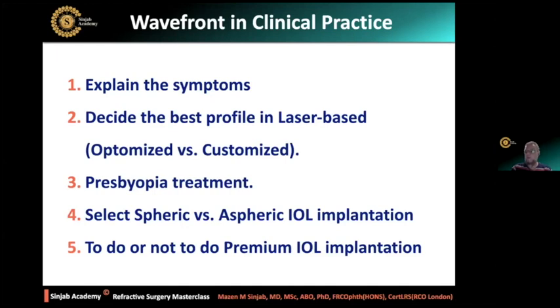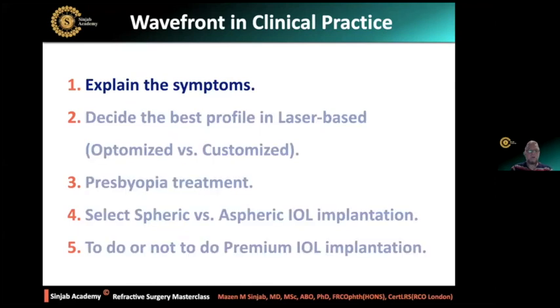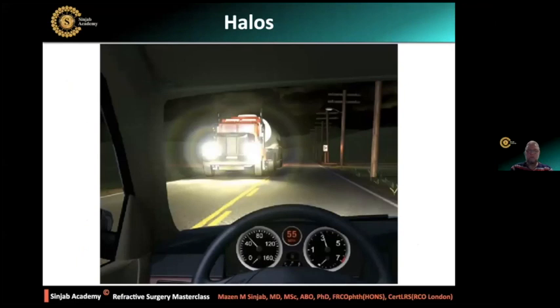And if it is aspheric, whether it should be asphericity 0, asphericity minus 0.27, or asphericity minus 0.20, which is the algorithm. To do or not to do premium IOL implantation, because if the eye is very much aberrated, we cannot implant a premium IOL. As I told you before, we can explain the symptoms of the patient.